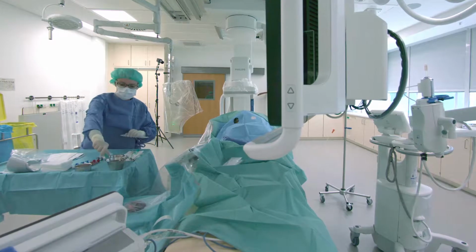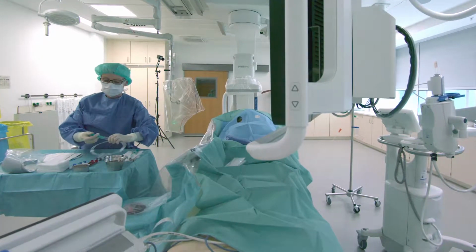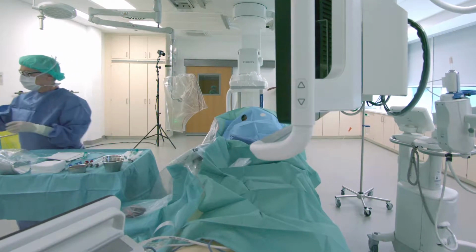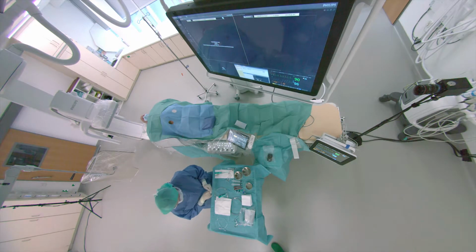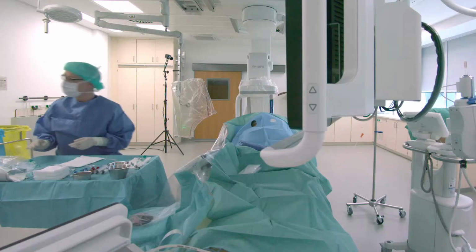The patient has now entered the room and is placed as far as possible to the head end of the table. This is very important, since you will have the ability to perform the procedure with the C-arm in propeller position and still be able to visualize the groin when necessary. The patient is covered with sterile drapes, and the OR staff is preparing the room and the materials which will be used for the procedure.